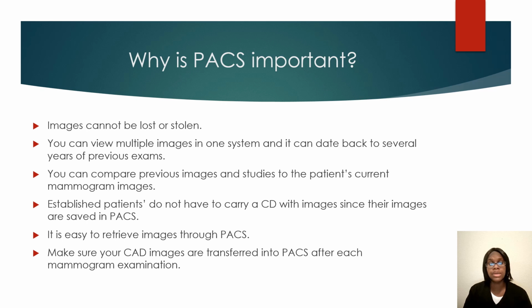PACS is very important because images cannot be lost or stolen. You can view multiple images in one system, and it can date back several years of previous exams. It's easy to retrieve those images. The patients do not have to carry a CD with them. They already have their images from the last time they came to the facility. If they are new to the facility, they will need their prior images. This may come on a CD, or this can get sent electronically.